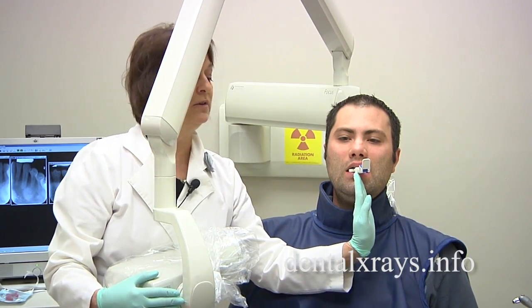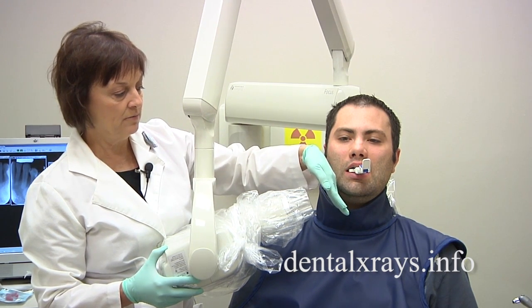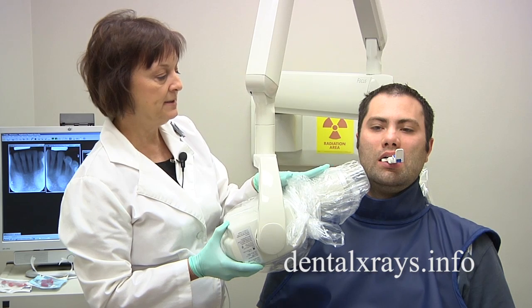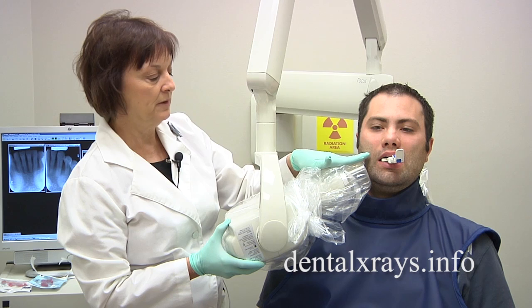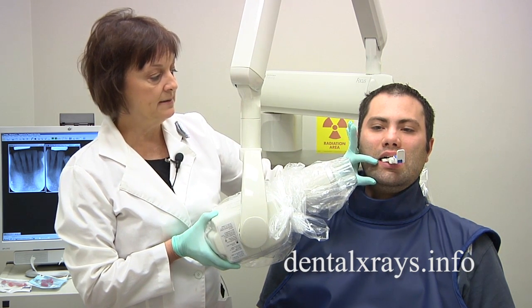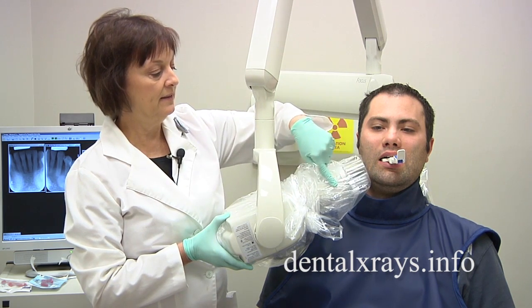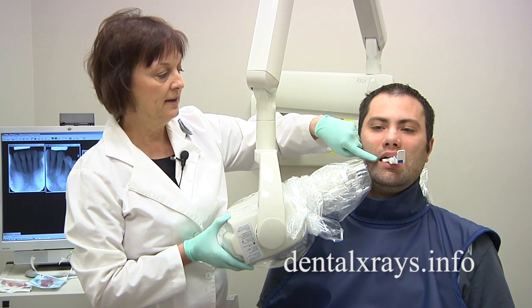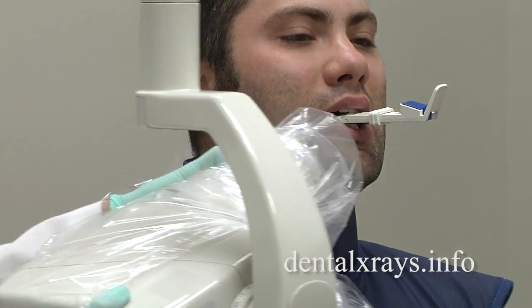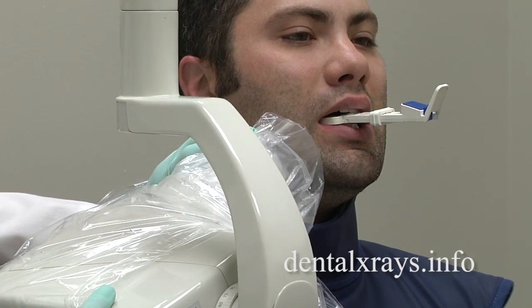Because the film is now slanting a little away from you, make sure that your vertical tube angle is slanting upward to accommodate the slant of the film, which is going under the tongue. Because it's slanted, you're going to set your vertical tube angle more in an upward placement when x-raying this premolar. Just make sure the top edge of the cone is covering the top edge of the snap array, because your film is right below the snap array and not above. The side of the cone should just skim the corner of the snap array so that you do not get a cone cut. You want to make sure the whole x-ray plate is right within the circle.